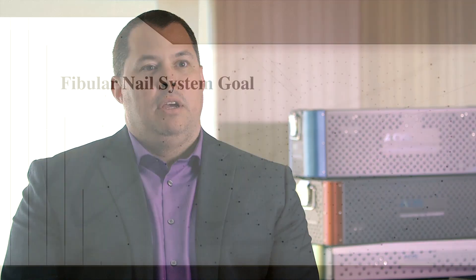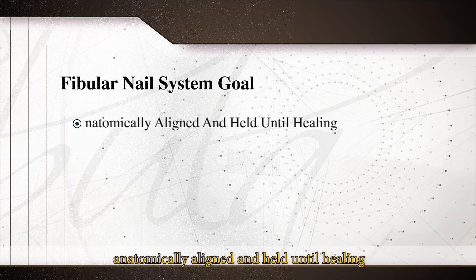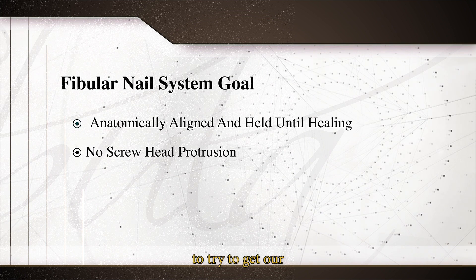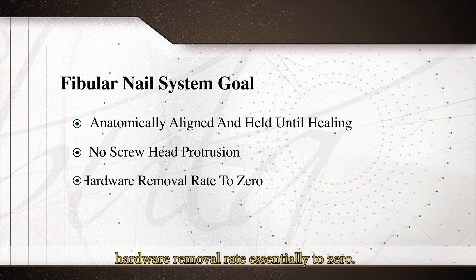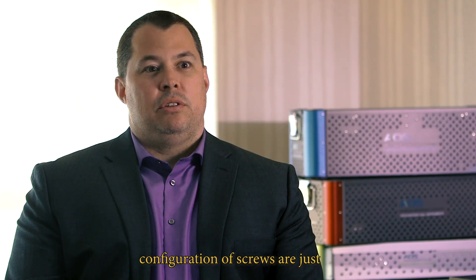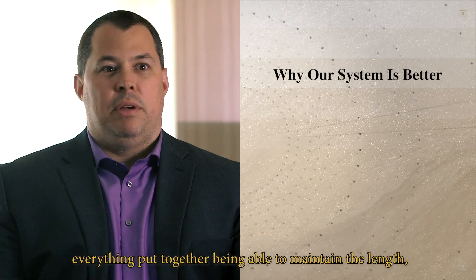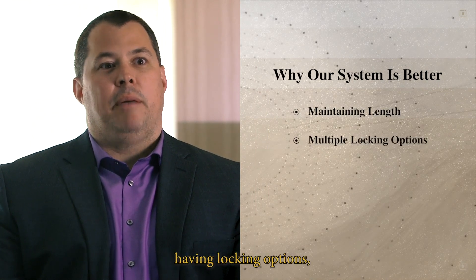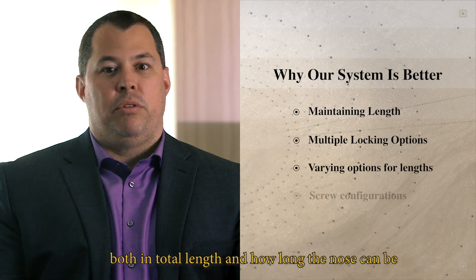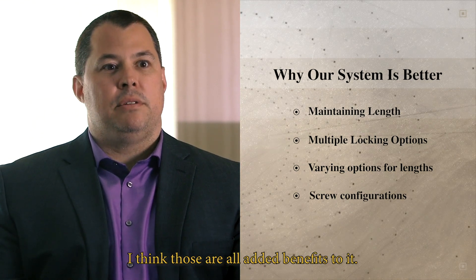The goal is to have the ankle fracture treated anatomically aligned and held until healing, with absolutely nothing sticking outside the bone — bringing hardware removal rates essentially to zero. The configuration options for screws are so much better than what's currently available. Being able to maintain length, having locking options, and having different variations in total nail length and nose length are all added benefits of this system.